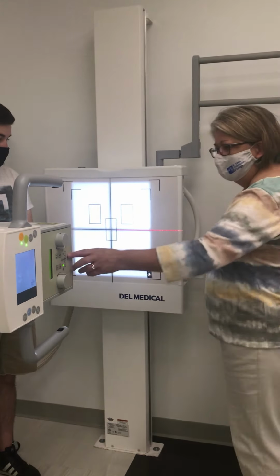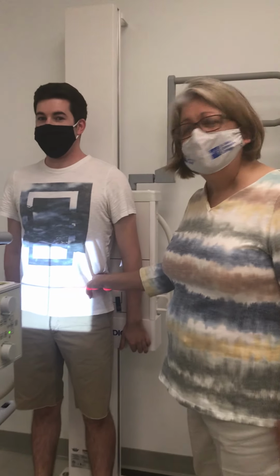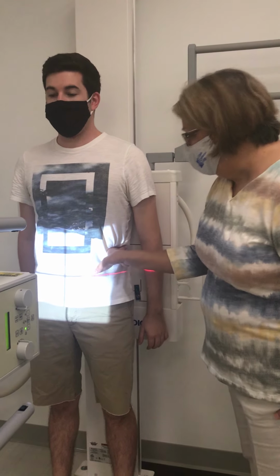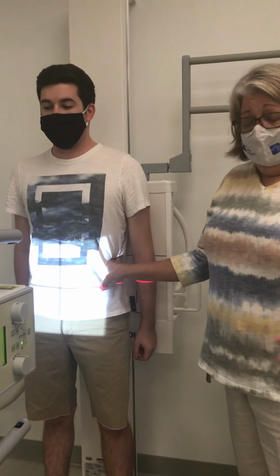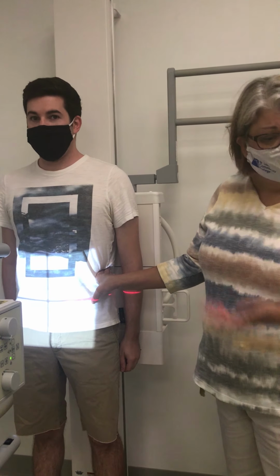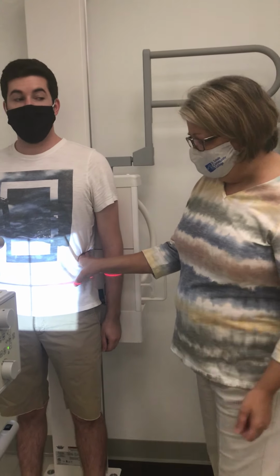Now, sir, if you would, place your back against this board. Stand with your feet shoulder width apart. Okay, now I'm going to center for the erect abdomen. So I'm going to feel for a place on your hip. Again, we locate that iliac crest. But since we want to demonstrate the air fluid level, we're not worried about including the bladder, so we don't need to see the symphysis pubis, so we can center higher, and we must center higher, because for the erect abdomen, we must include the diaphragms.